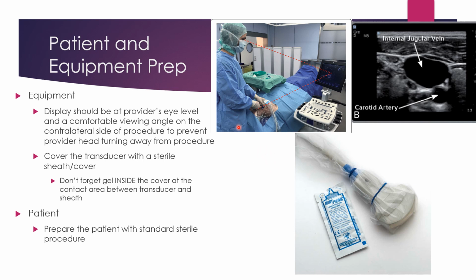This physician here did a great job. They've got the patient's head at this end. They're standing at the head so that they can advance the needle downward into the jugular vein. And with just simply looking up or down, they can watch what they're doing with the needle placement and then how that's adjusting the view on their image at the same time.